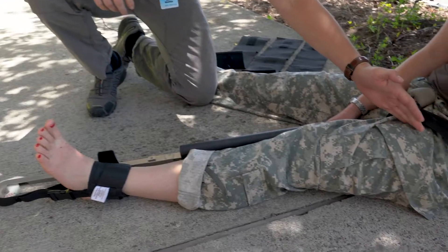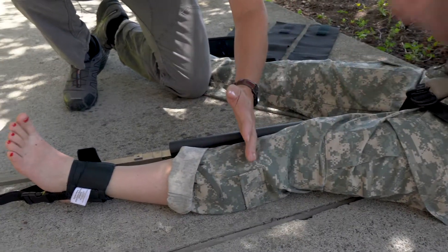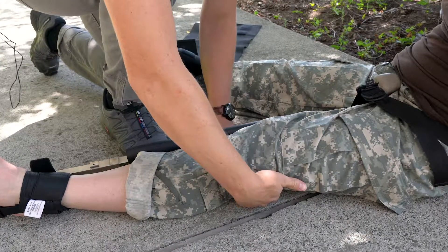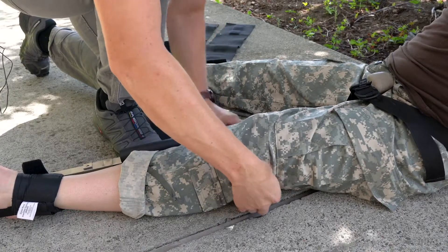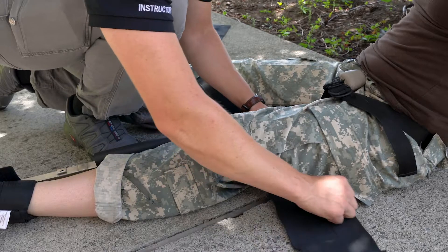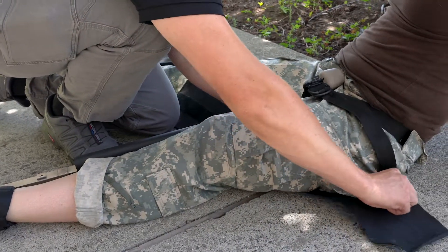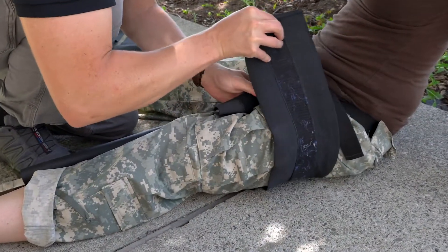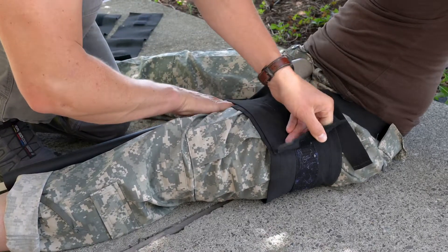The longest strap goes highest on the patient's leg, the second longest goes just above the knee, and the shortest just below the knee. There's a void underneath the patient's knee — it's usually an easy place to slide the strap underneath. When coordinating with your partner holding manual stabilization, use a zigzag motion to position, place, and tighten the strap without causing unnecessary displacement.